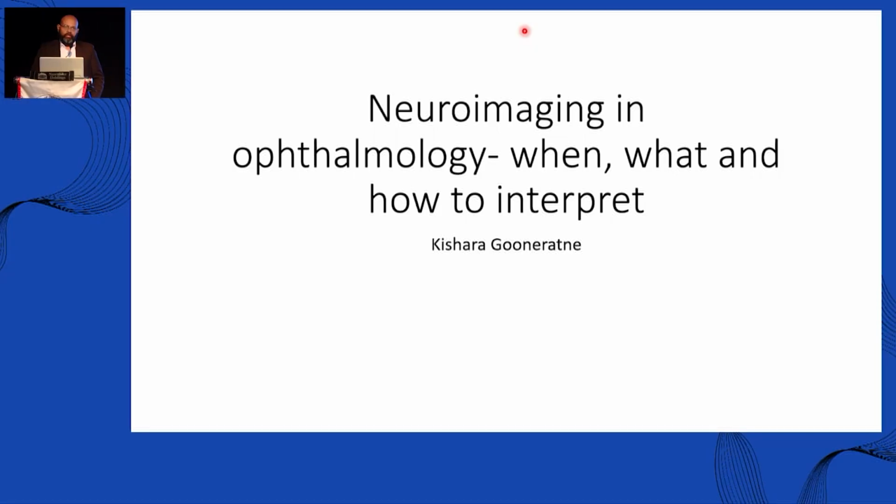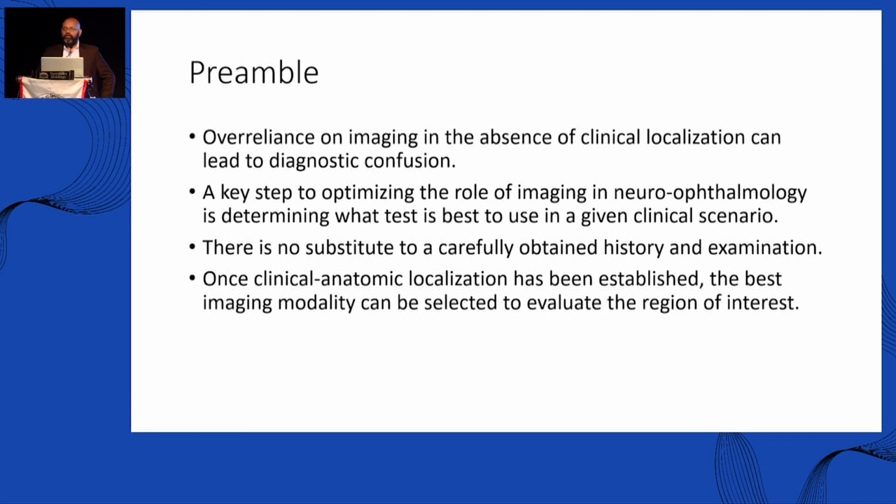My talk today will be on neuroimaging in ophthalmology. And at the outset, I'd like to thank the college for giving me this opportunity to speak to you. Fifteen minutes is probably not enough for me to speak to you on the intricacies of neuroimaging, so I'll be focusing mainly on MR imaging, and mainly on MR imaging around the orbit.